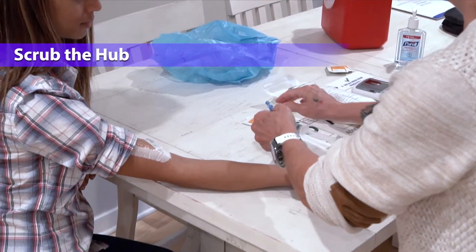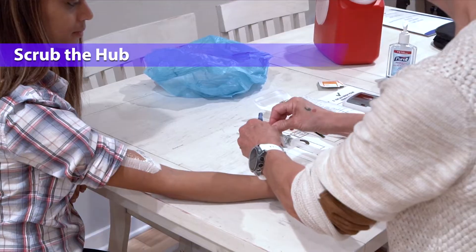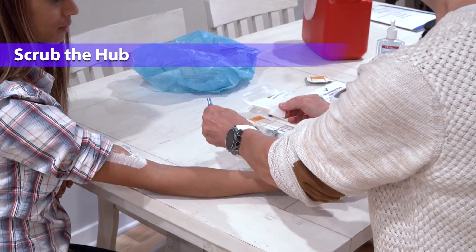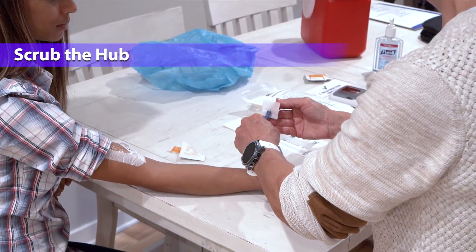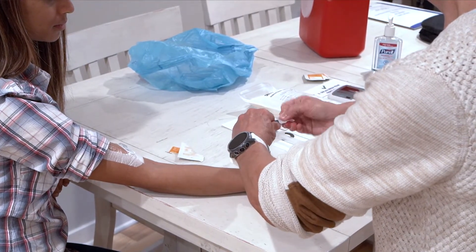Now you will scrub the hub. Hold the end cap between your fingers and scrub the hub — which is the tip of the end cap — for 15 seconds with an alcohol pad. Do not put down the end cap. Discard the alcohol pad.